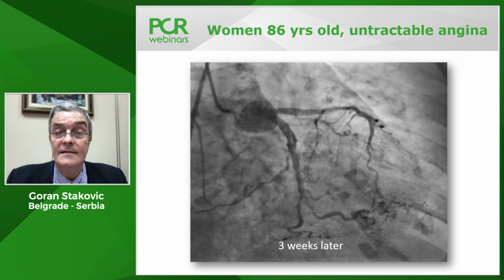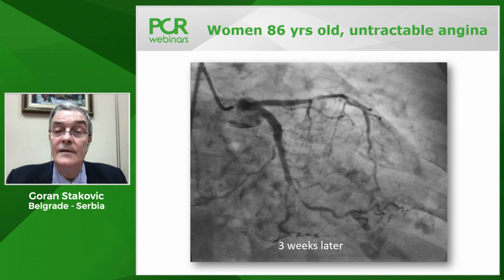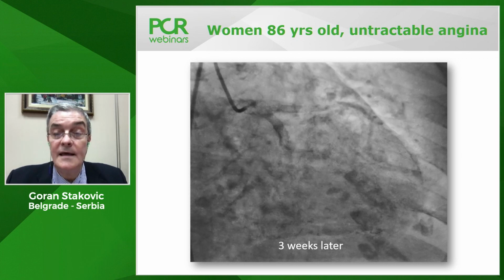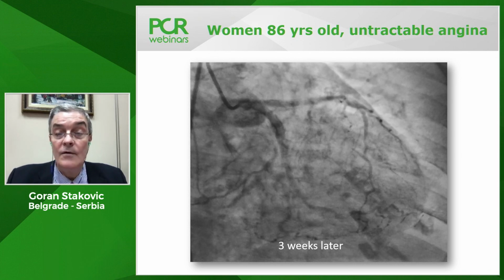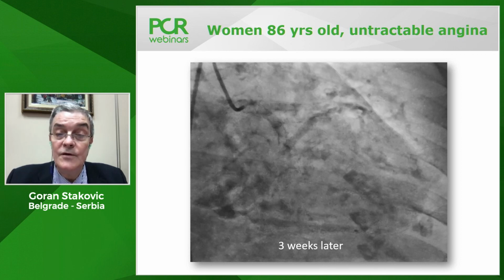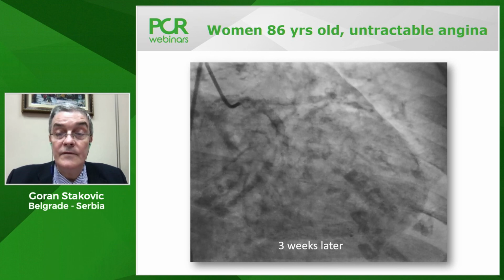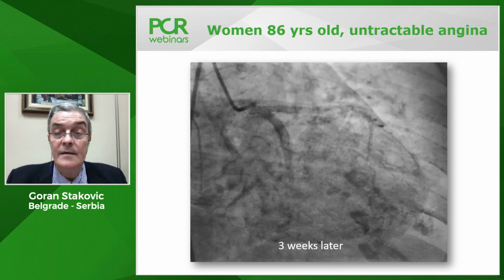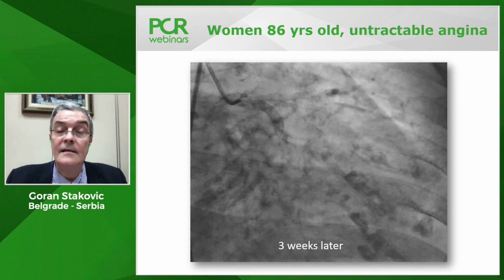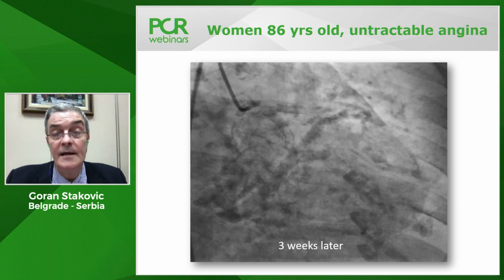to know the 7 steps that Prof. Tan will clearly denote and explain later on in his case. But from my personal perspective, I have a long-lasting experience with provisional stenting or inverted provisional, and in case of diffuse disease, I would still do culotte in my lab, and I'm sure that an optimal result checked by IVUS will guarantee good long-term clinical outcome.